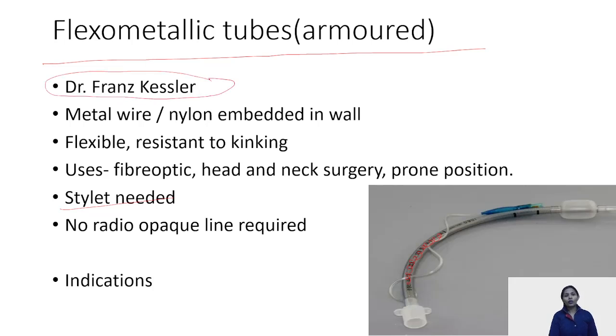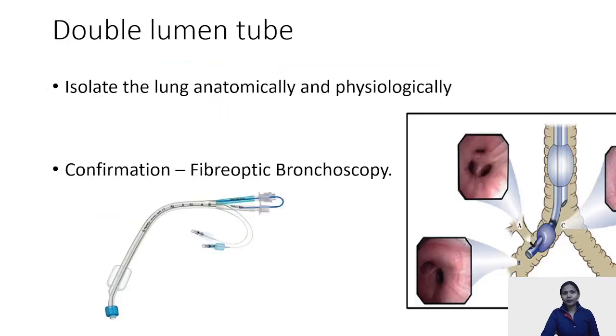One time only this has been asked: who introduced this flexometallic tube? It was Dr. Franz Kessler. He introduced these flexometallic tubes, which are also known as armored tubes. They are flexible and non-kinkable.